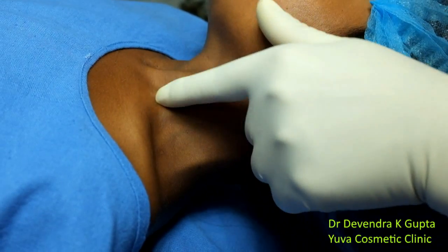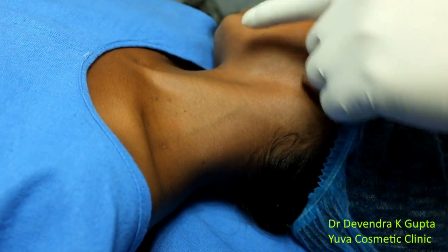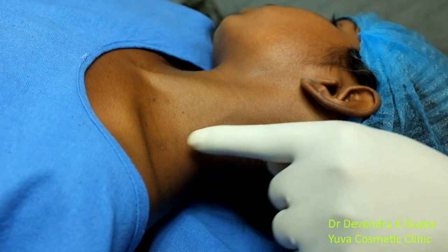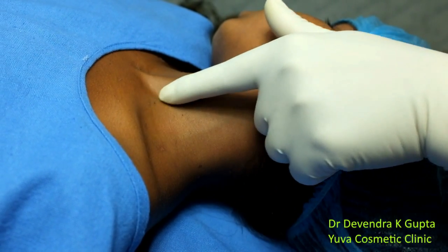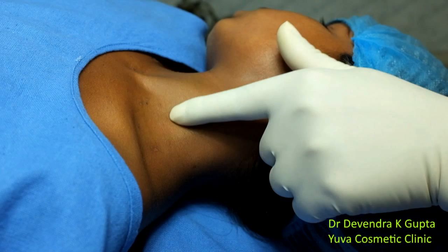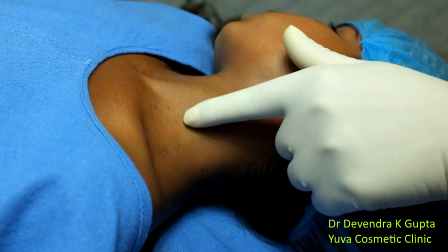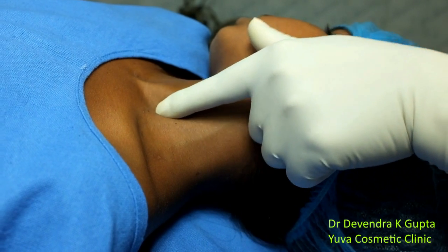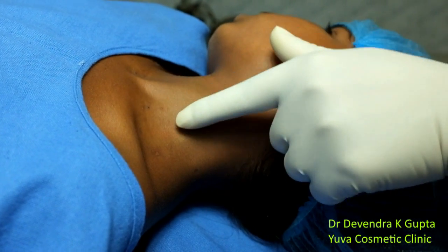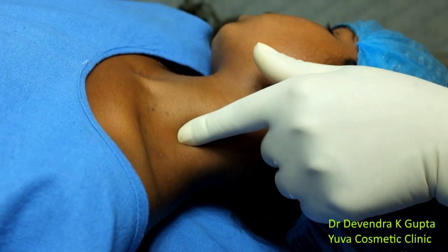Now you can notice both heads of the sternocleidomastoid. You can see the external jugular vein here. Just put your finger on the lateral head, or the clavicular head, of the sternocleidomastoid, roll the finger laterally, and after the lateral head you can feel a groove in between two muscles.